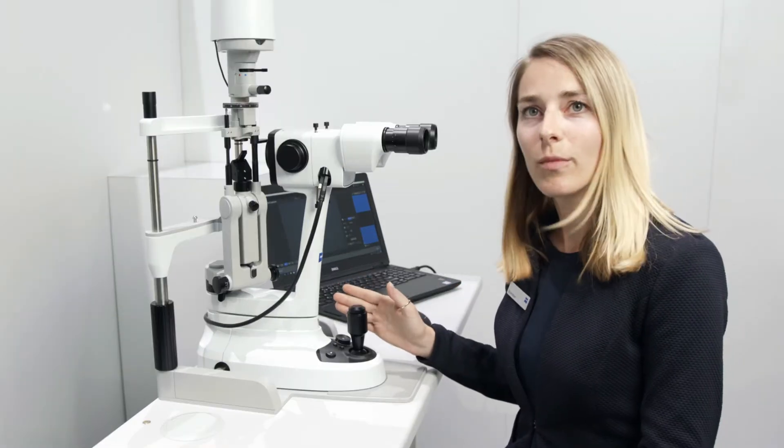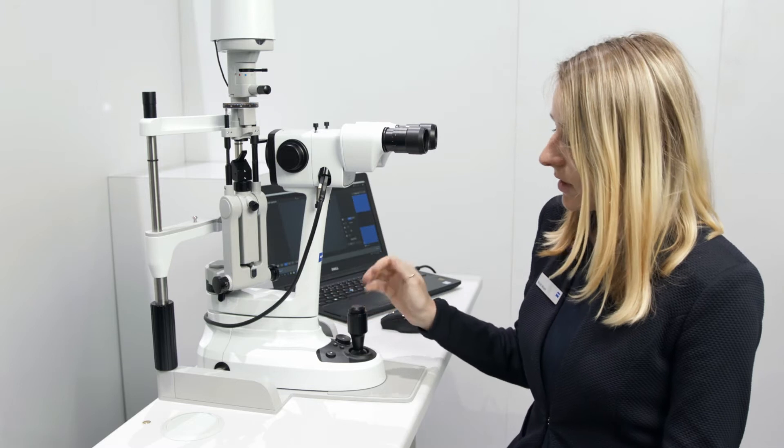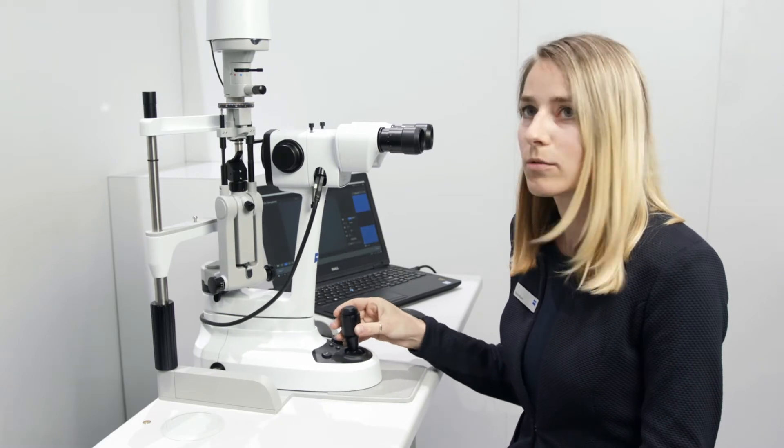We have a so-called echo mode, which means the slit lamp will go to sleep after three minutes. The light turns off, the quick action brake comes in, and as soon as you touch it, the slit lamp is ready to be moved again.